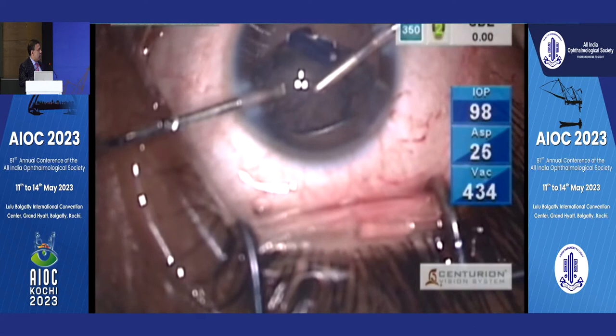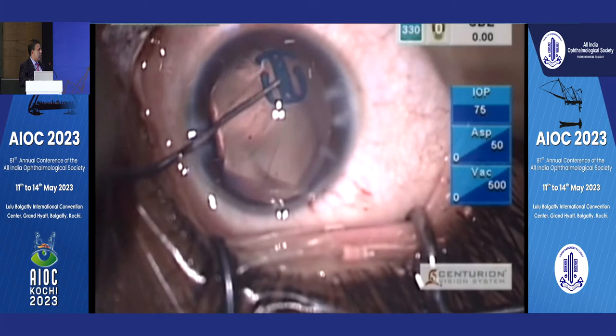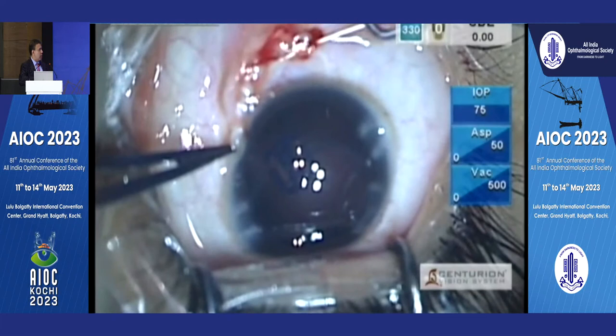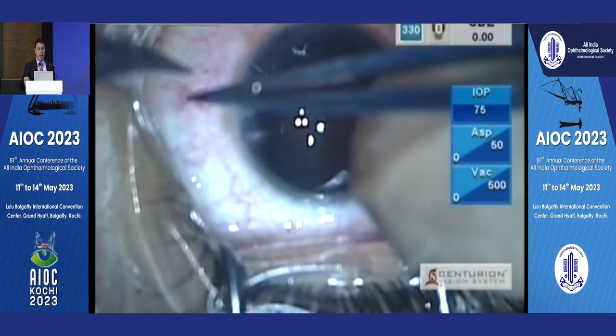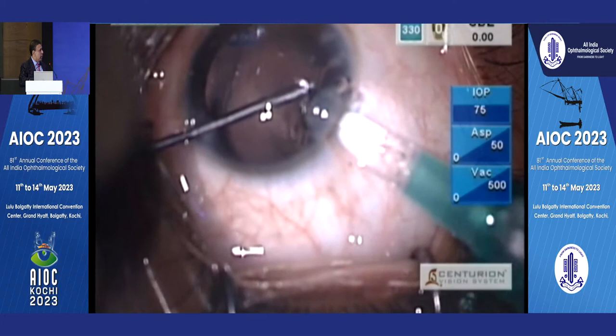Suck out the cortex. The anchor is lying there on top of the capsular bag — it looks like it might fall inside, but there's a web of zonules there so it's just lying there. You enmesh the capsular bag in the two trailing legs of the anchor, which looks like a boat anchor that snags on something. Then pass the needle twice through the sclera to lock it and pull it tight. Interestingly, this patient was a ten-year-old boy, and one year after surgery he got hit on the eye with a ball — the anchor, bag, and everything went inside including the lens.